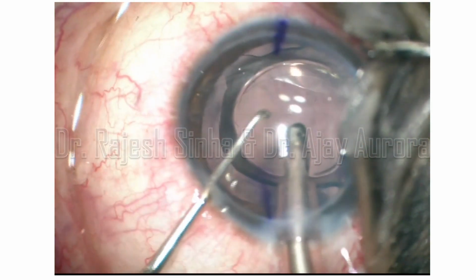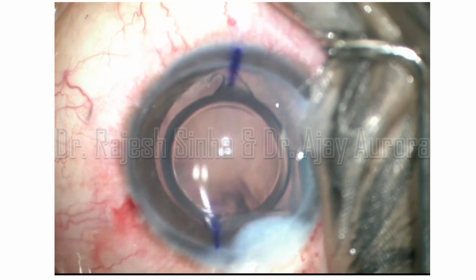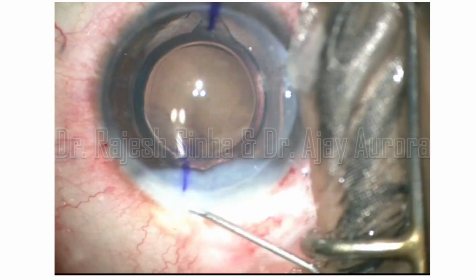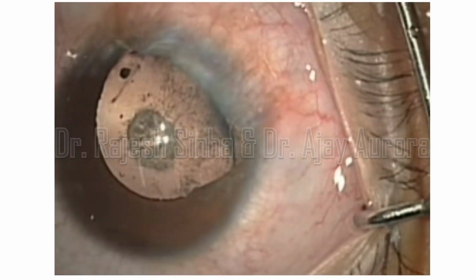A case of operated DALK where an intraocular lens has been implanted. This is a toric implant and it is quite effective. You can see here the mark of the IOL is well aligned with the mark on the cornea.